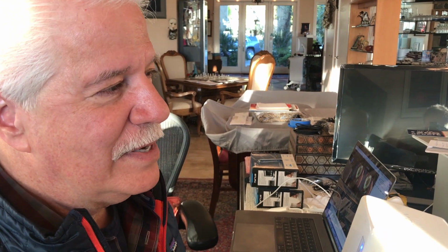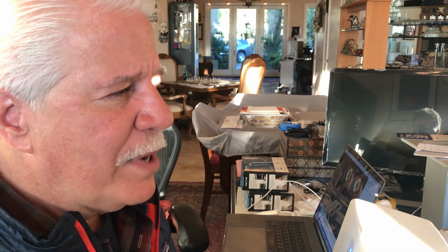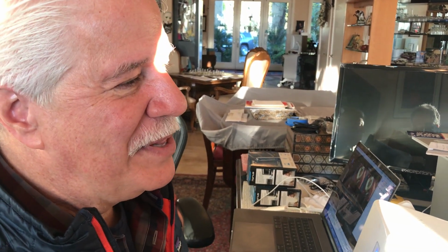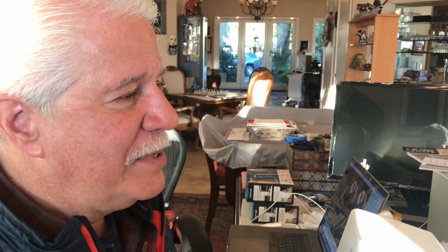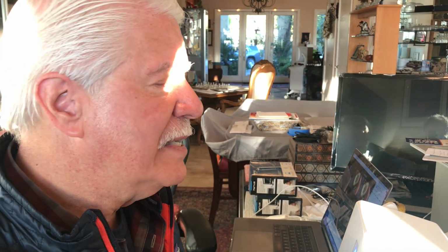Even though I like the zen feeling of being on a microscope and having no peripheral vision, and therefore none of that visual noise, that you'd be giving up. But still, you could probably put on some glasses if you wanted to have some blinders to reduce peripheral vision if that really bothered you. I find it very pleasing working on the microscope, looking at the task at hand and not seeing the auxiliary or anything else going on in the treatment room that might be distracting from the task you're trying to perform.